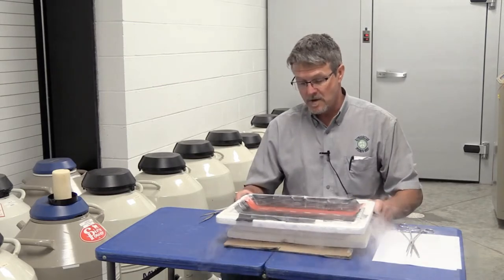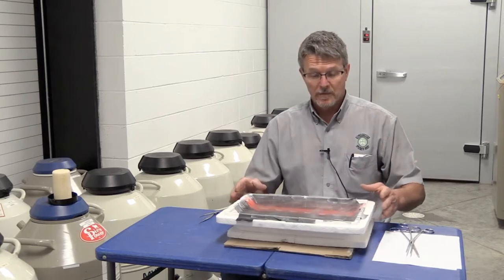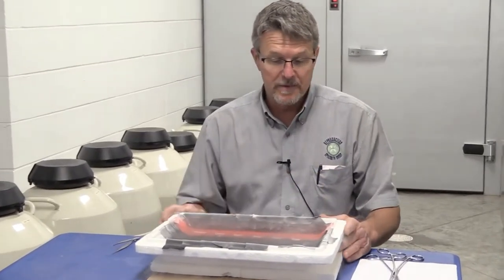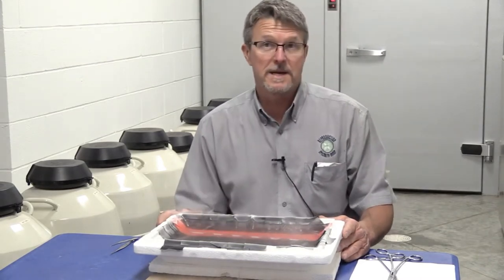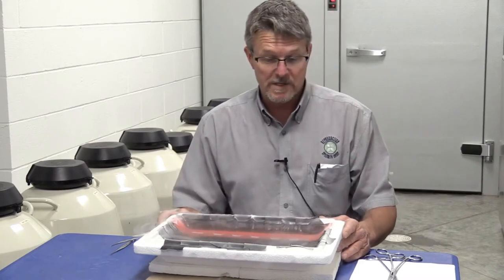What we have here is basically a lid off a styrofoam cooler. We tried to find something that would be accessible to everybody. What you'll need to do is darken the bottom of this lid so you can see the straws in there. We've taken black duct tape and put it on the bottom, and that gives us a nice dark background so we can see the straws.